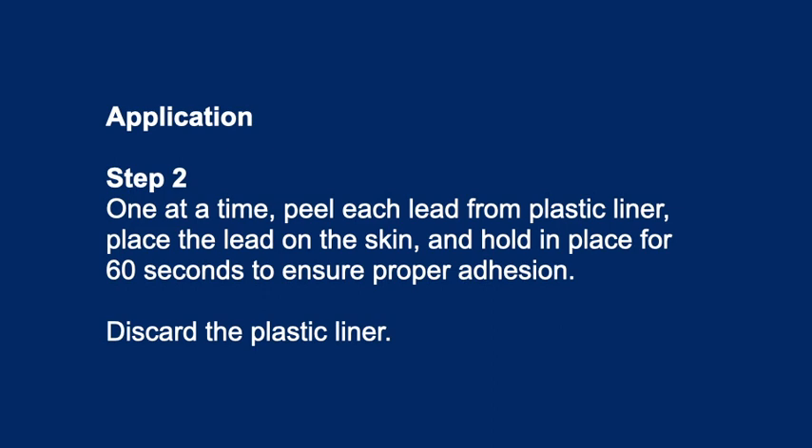Application Step 2: One at a time, peel each lead from the plastic liner, place the lead on the skin, and hold in place for 60 seconds to ensure proper adhesion. Discard the plastic liner.